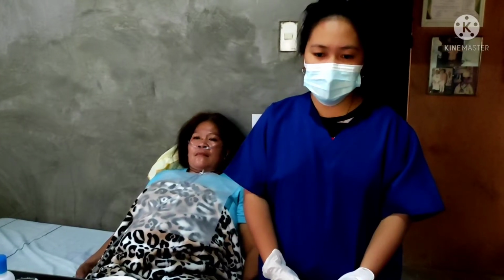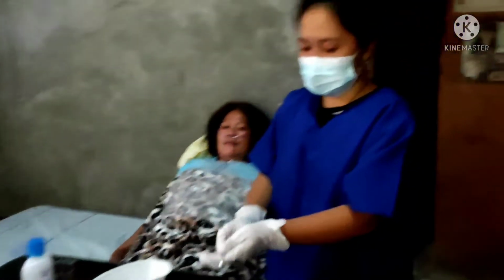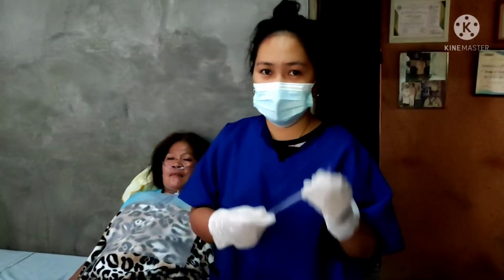Verify that the suction mechanism is working properly by suctioning a small amount of sterile saline from the basin. So, let's assume that this is a catheter.